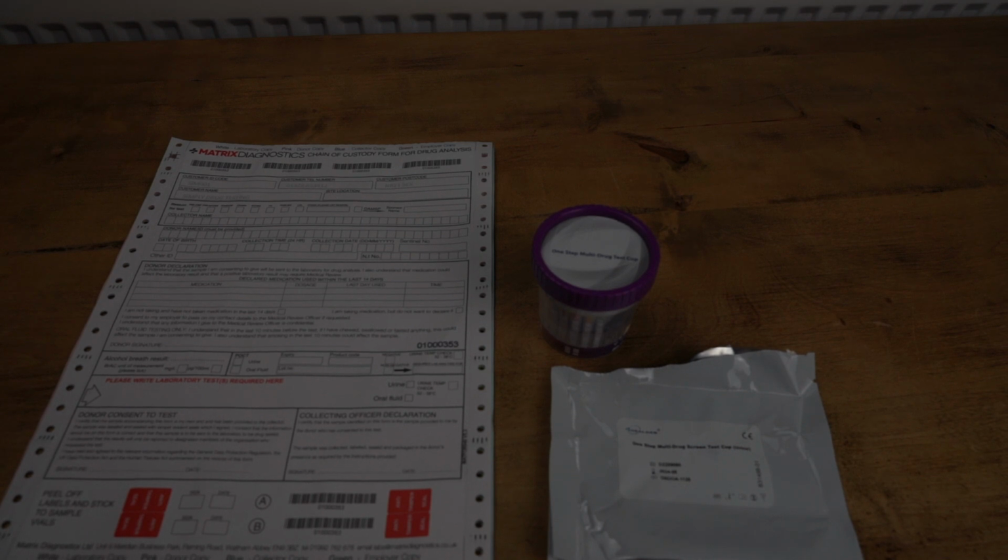So your employee has failed the first line drug test, and we now need to prepare the sample that they've given us and send it off to the laboratory. Initially we asked them to provide urine, and they urinate into the pot or the cup as we have here. In a few minutes I'm going to show you what to do with that sample of urine, but we need to go through the chain of custody test consent form first.